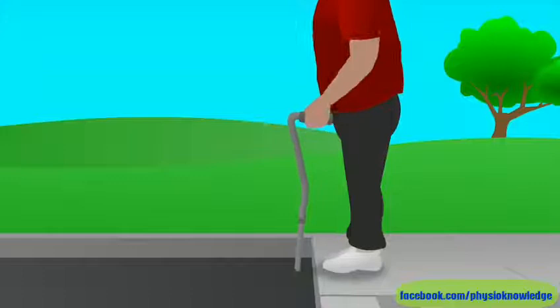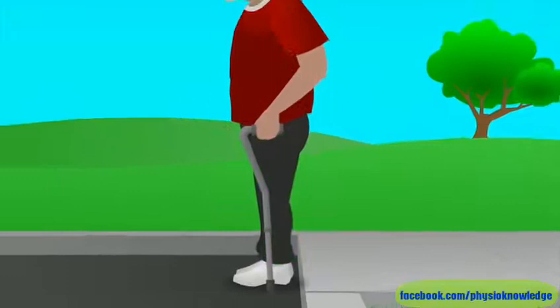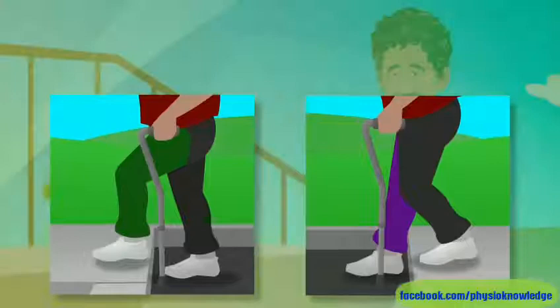If you're going down, move the cane down first. Then step down with your weak leg and bring your strong leg down to meet it. When you reach the level surface, get your balance again before you start walking. Remember, up with the good and down with the bad, to help you lead with the correct leg.